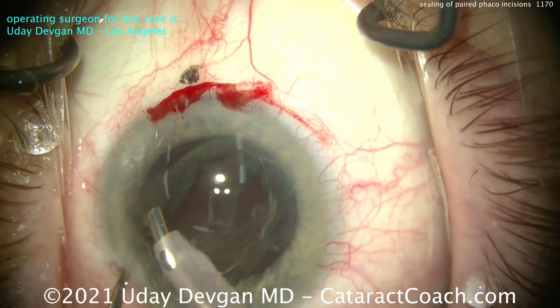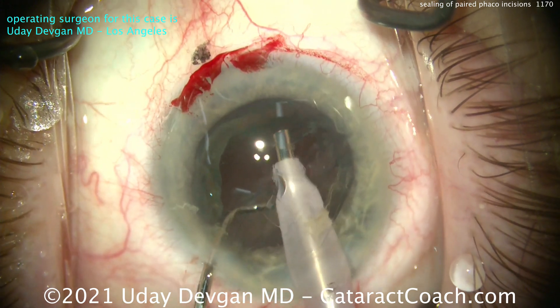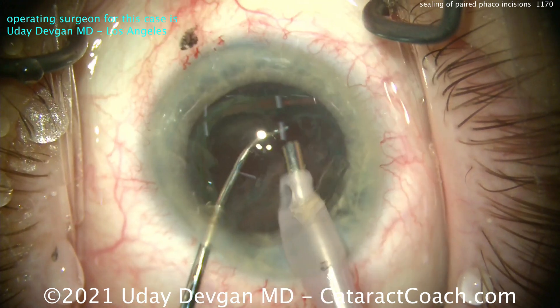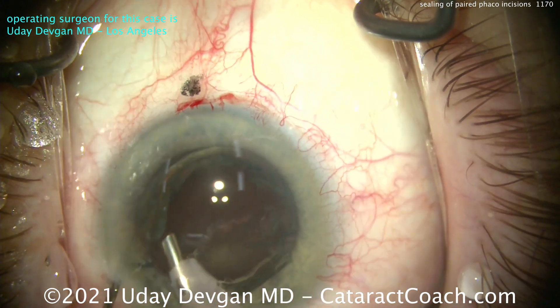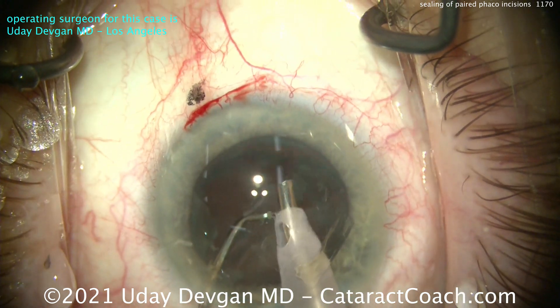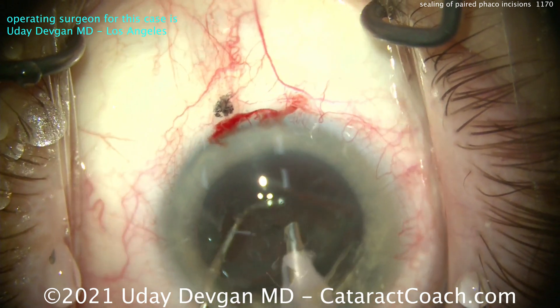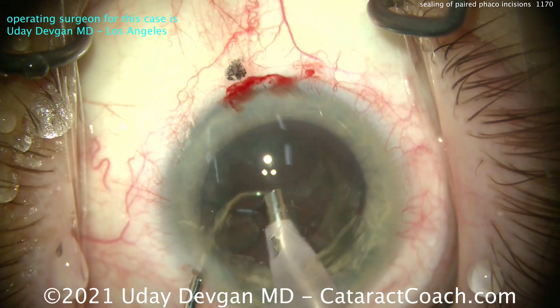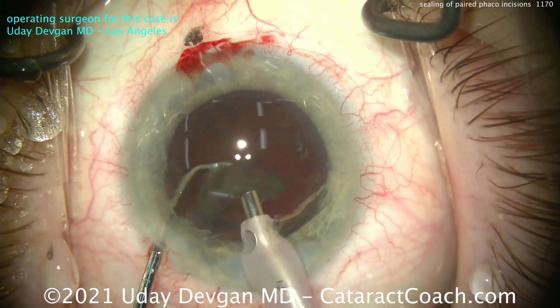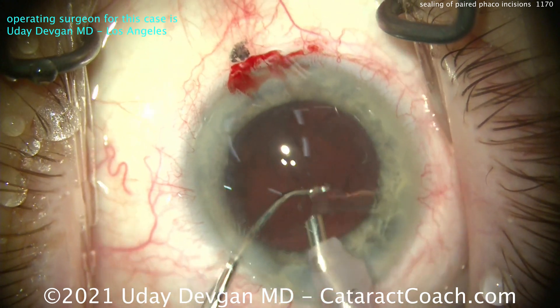That's because of the nature of the incision. These incisions are made in such a way that they act like a valve — the higher the pressure in the anterior chamber, the better that incision will seal. My technician squirted the eye and washed off some of the blood from that extra incision, but you can see it just does not leak. The diamond keratome — or even a steel keratome — makes a beautiful, precise, sharp, clean incision that'll seal beautifully on its own.